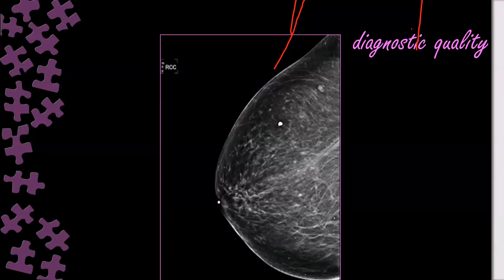Any fault in this image? No fault? Nipple is not central. The nipple is not central. This is exaggerated. Look, standard lateral. Yes, it is standard lateral. Look, only one third medial and two third lateral, or even more. Look for the nipple. This is one. What else?